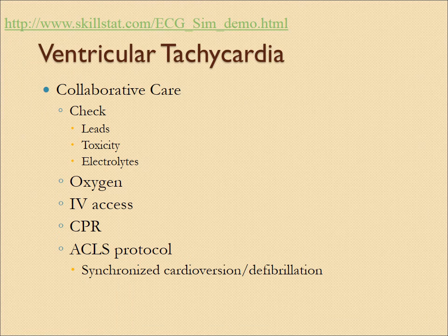So, what are we going to do? Well, first off, we're going to run in and see this patient, and sometimes somebody has just been scratching their leads. We're always very happy when we've had the scare, but it ended up being just the leads. But basically, when this happens, this is an emergency situation. If this patient is unresponsive, which many times they are, there are some people that can tolerate ventricular tachycardia for a period of time, but most can't.